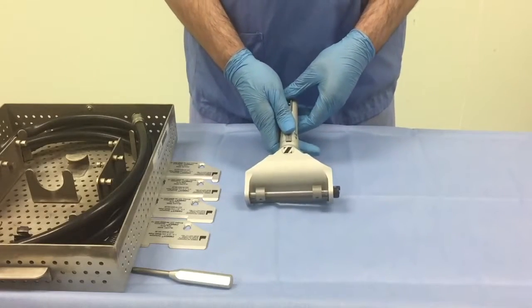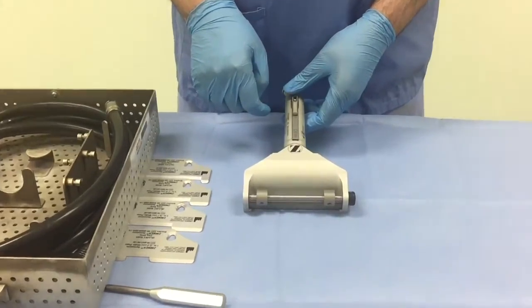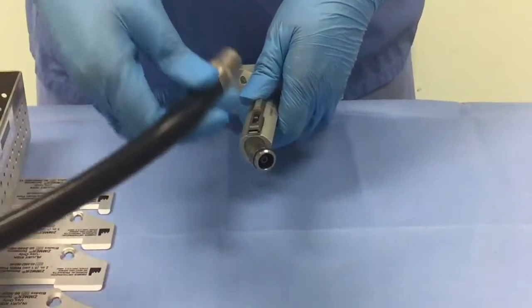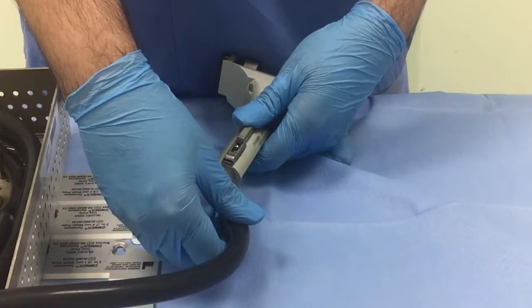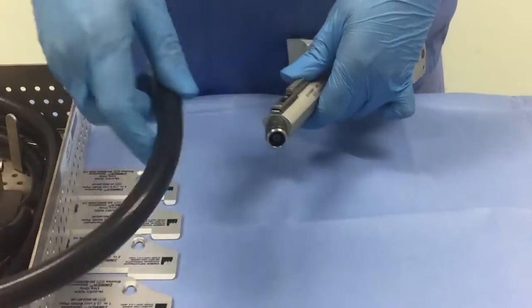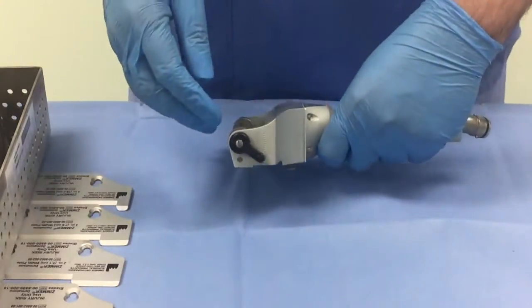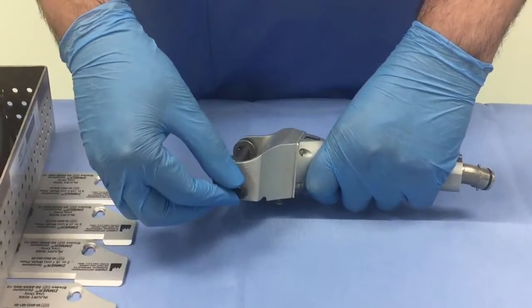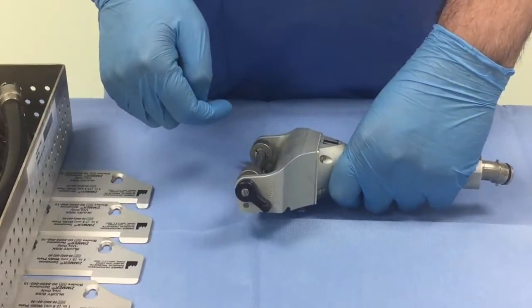This is the pneumatic dermatome. The front end has two rollers which controls the skin graft as it comes out. The back end is the connection to the pneumatic air hose, which connects in a clip fashion. The other end of the air hose connects to the main air supply. Along one side of the dermatome is the lever to control the thickness of your skin graft, marked from 0 to 30 thousandths of an inch.